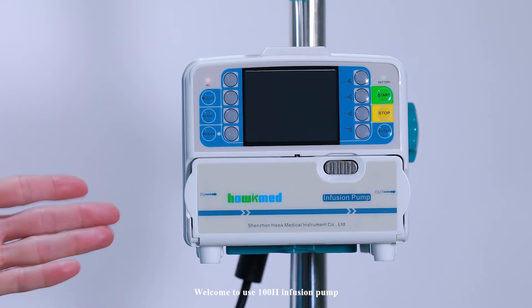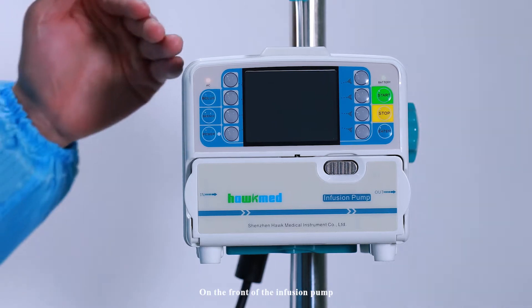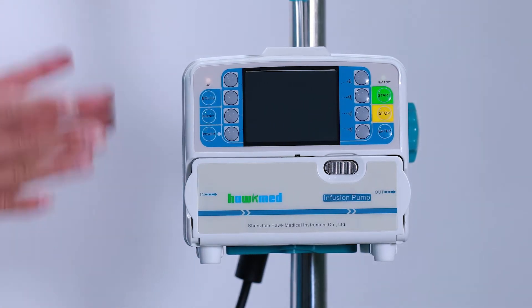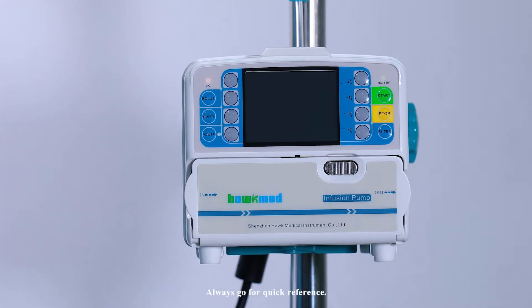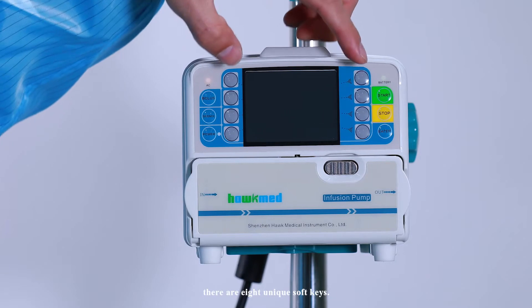Welcome to use 100II infusion pump. On the left of the infusion pump, there is a quick start guide — always go for quick reference. On the front of the infusion pump, there are 8 unique soft keys.